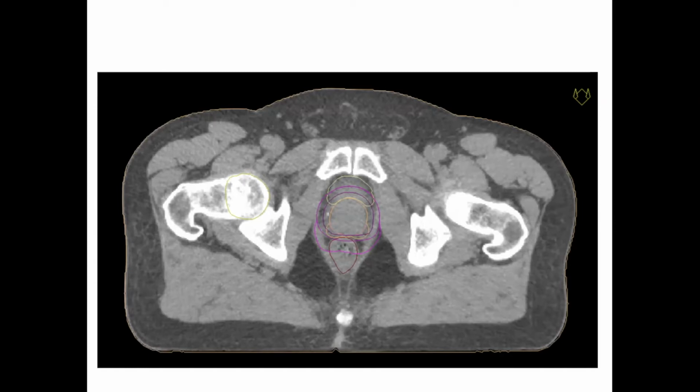So this is sort of conventional treatment, not brachytherapy. I'm just going to show this to give you some comparisons. And what you can see in the middle there, hopefully, are a variety of different coloured lines. And this is what we as the clinical oncology team do. We come along and we draw on the bit that we think needs to have treatment. So we've drawn some orange lines here in the centre, and then those orange lines are grown into these purple and pink lines, which become what we call the planning target volume. So the safety margin around the bit that we want to treat.